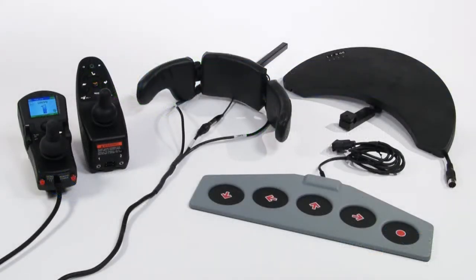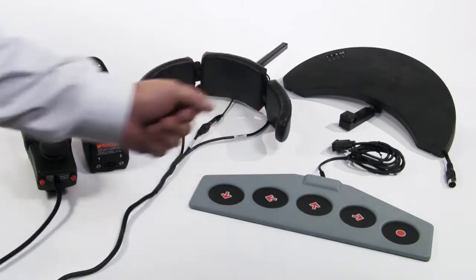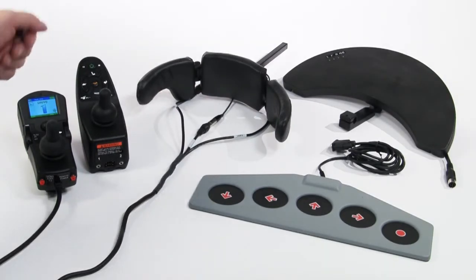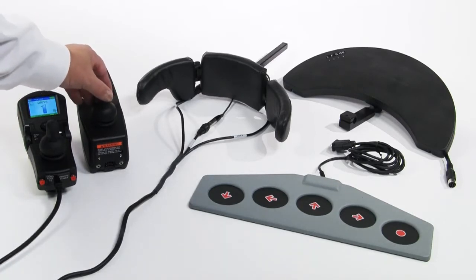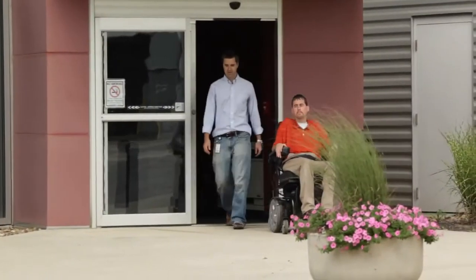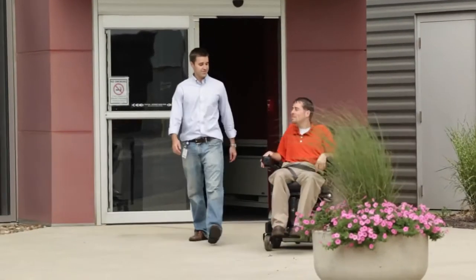All power wheelchair driver controls, regardless of the manufacturer, fall into one of two categories: proportional, also called analog, or non-proportional, also called digital. A proportional driver control operates with similarities to the gas pedal of a car. The farther you push or move something, the faster the wheelchair will go. A traditional joystick on a power wheelchair is a great example of a proportional control.